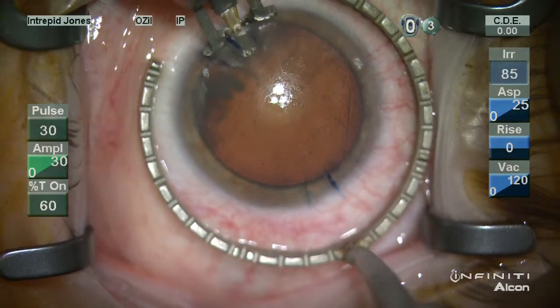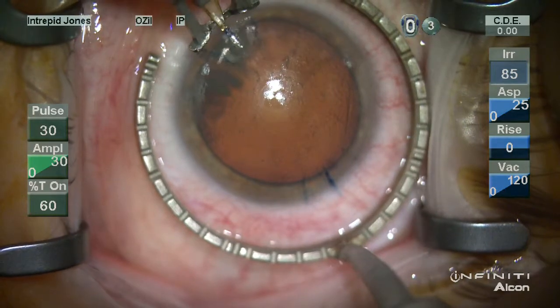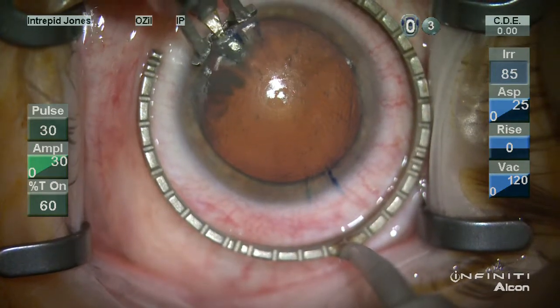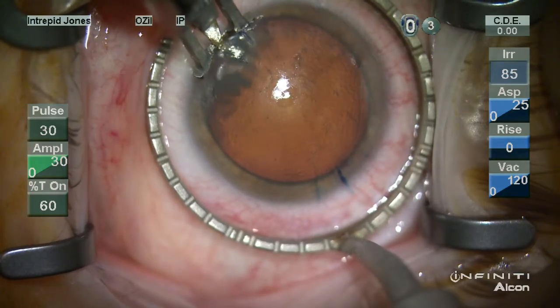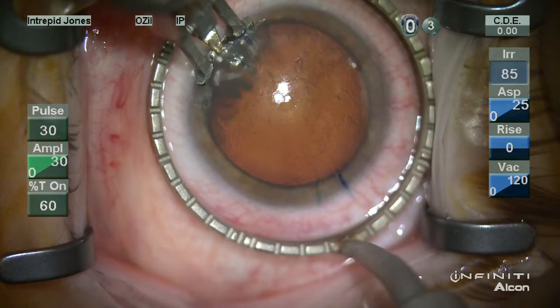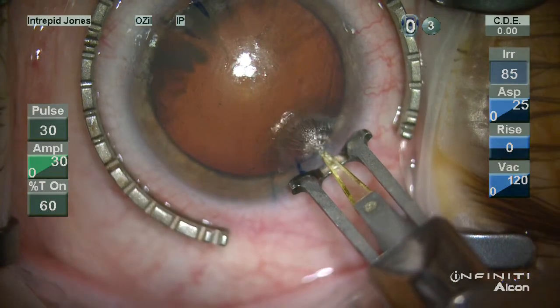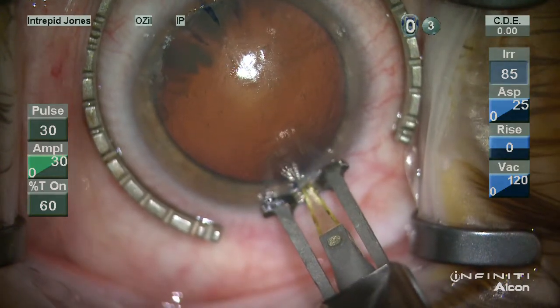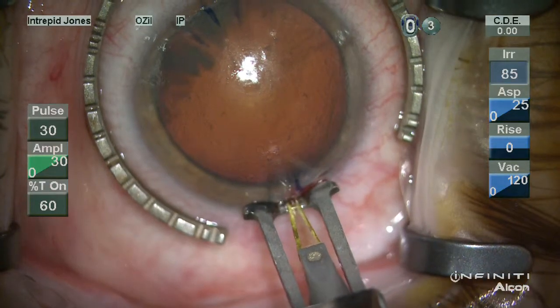In this example here, we're placing our main wound on axis as well as using an LRI. You also see here this technique of lifting the blade and replacing it. This also tends to help if you're having any issues of rotation in orienting your blade in an arcuate manner. Now for the main wound, the incision is made in essentially the same manner, however it is slightly more peripheral. And you can see here we're going to get some heme that does fill this channel and helps to delineate where we've incised.